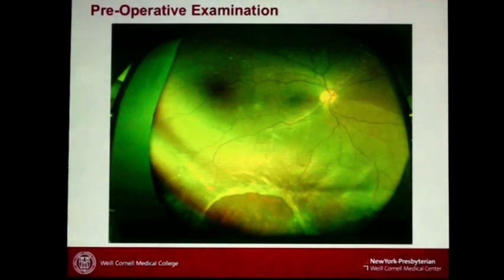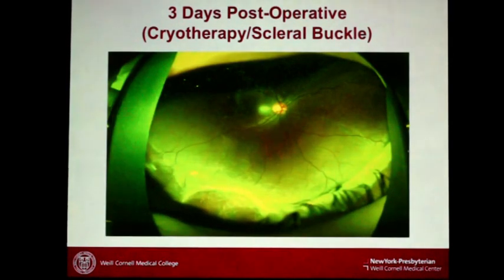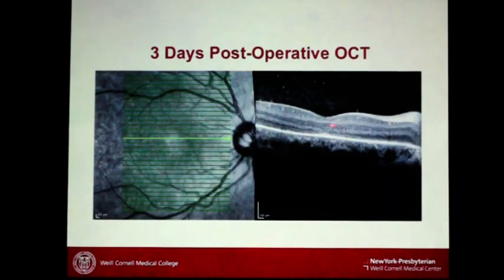Here's a large tear, detachment. You can see here that this area is the only area that's attached in this young child. Here's the OCT. The macula is completely off with cysts. Here's 3 days postoperatively. I've got a buckle here. Here's the tear. Here's my OCT.